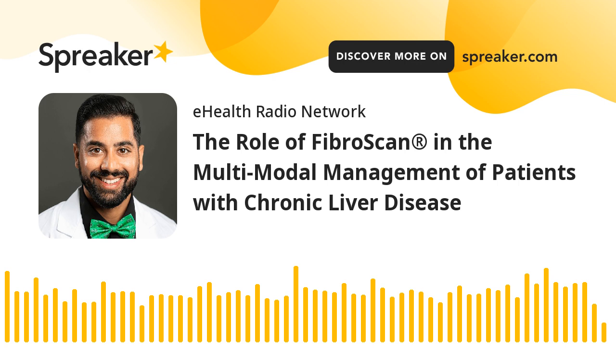I think some key takeaways could be that initial care begins by recognizing this at-risk population, and FibroScan is both a screening and diagnostic point-of-care device, which is now at the focal point in those with chronic liver diseases, including NASH. There are over 30 medicines for NASH in various phases of clinical trials. Treatment options such as intragastric balloons and bariatrics are now FDA approved for NASH. Bariatric surgery such as a sleeve has been showing a change in the actual natural history of select patients. Several obesity medicines are now leading to weight loss and improvement in our patients' FibroScan interpretations, noted personally in our most recent studies within our institution.